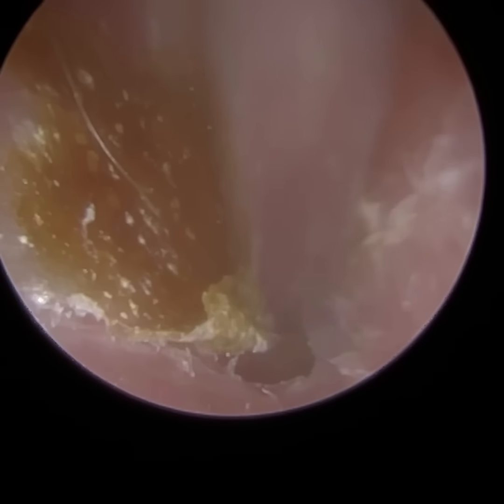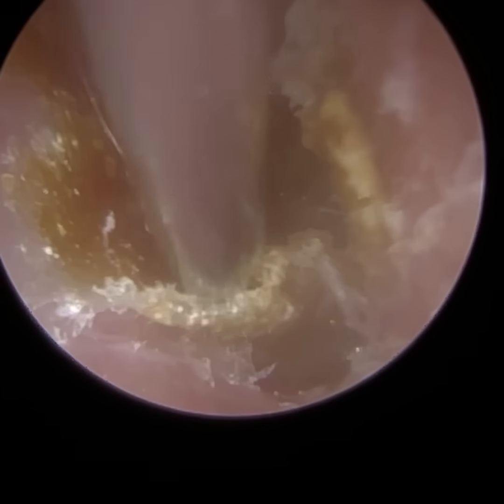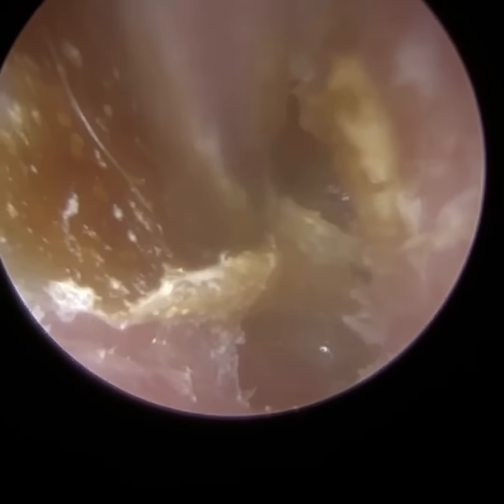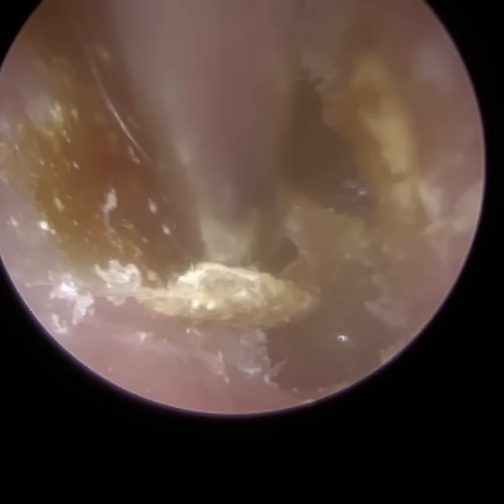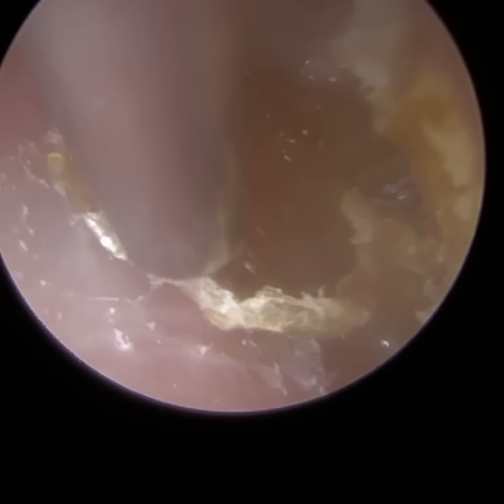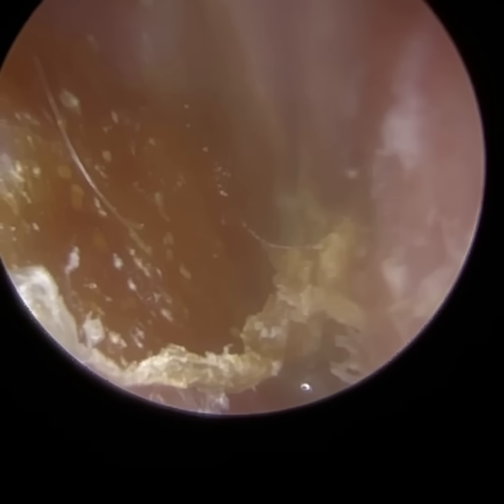Now, the skin is called a keratinous, stratified, squamous epithelial skin. And the process of the skin migrating, we call that epithelial migration. Now, the word keratinous refers to the protein keratin.